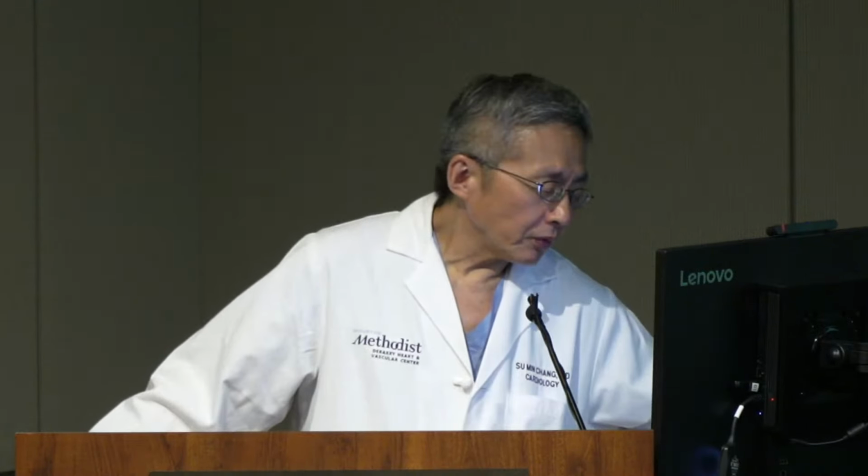Okay, but again, remember the title is cardiac CT, and the coronary CTA. For current applications, people are interested in mostly knowing the stenosis or not, and now more and more the plaque composition. For now, we need to give contrast, right? But if the only thing you're interested in knowing is that the patient has calcific plaque, you can do a non-contrast scan.